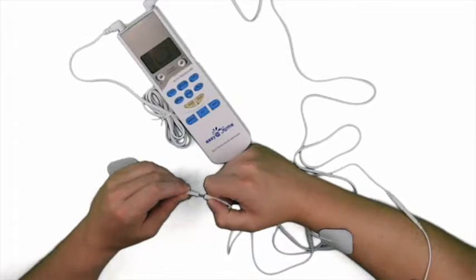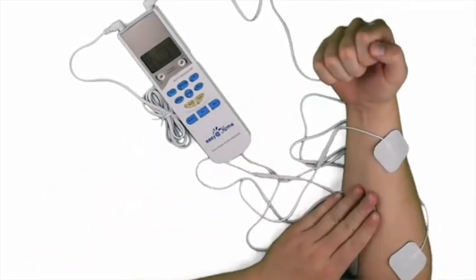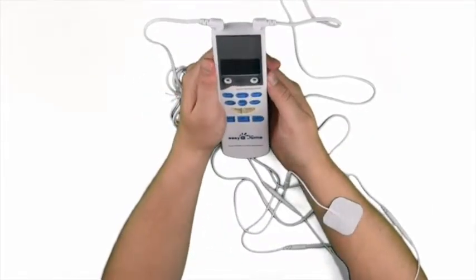Simply connect electrode pads to leads and the opposite ends to the device. Apply self-adhesive pads to troubled areas. Turn on the device, set your preferences, and enjoy the relief.